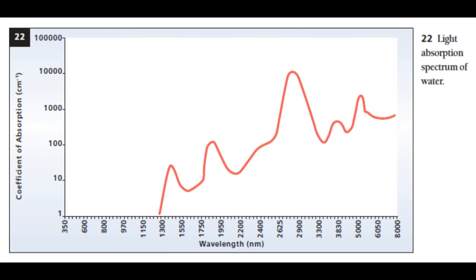It was suggested, then, that such temporary structural alterations may induce functional changes in the sebaceous glands and, possibly, sebum production and composition. These proposals remain speculative, and recent studies of sebum production following laser treatment have provided inconsistent results. Future studies will need to identify additional factors that may be contributing to the improvement in acne lesions seen with these lasers. Treatment specifics.